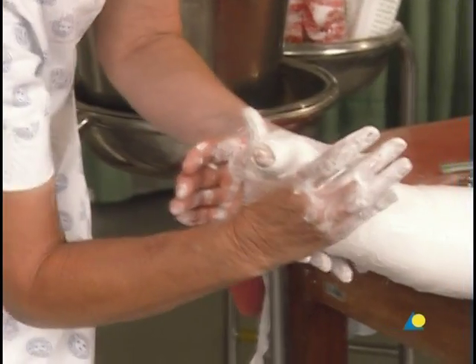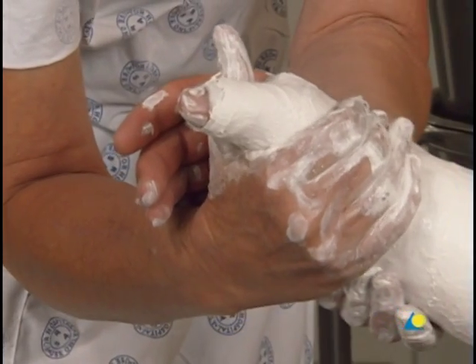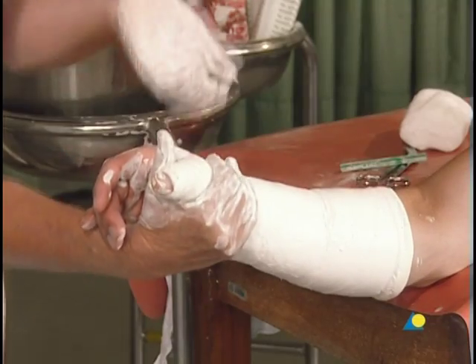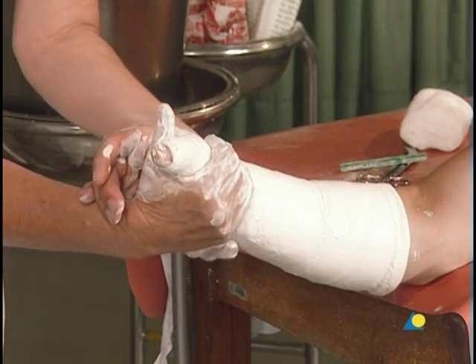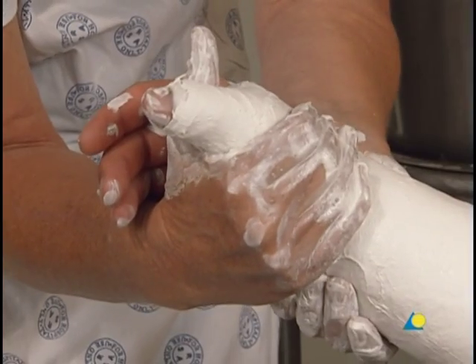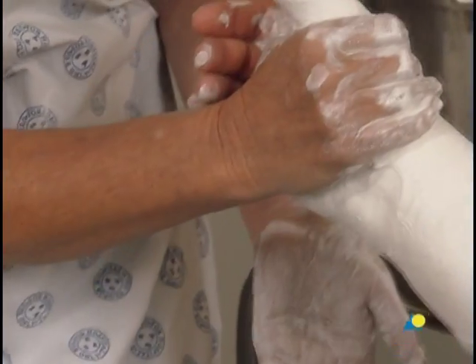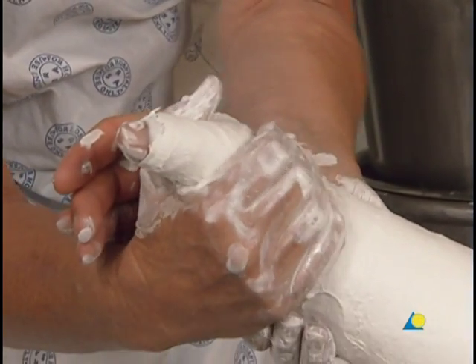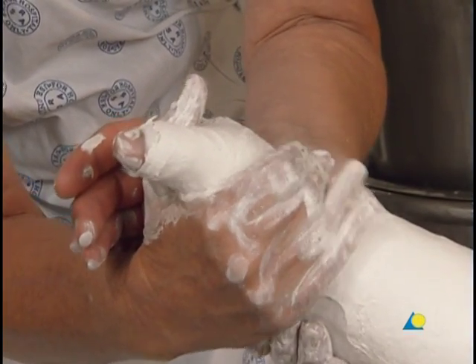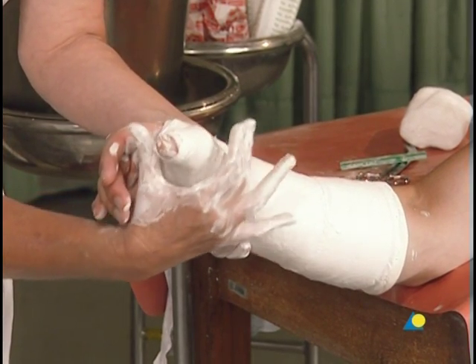The cast is molded by gripping the thumb and wrist with one hand, as shown. The second hand applies counter-pressure at the ulna. Care should be taken not to push the thumb into hyperextension.